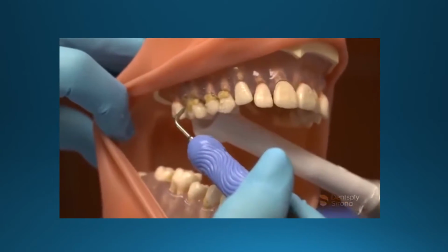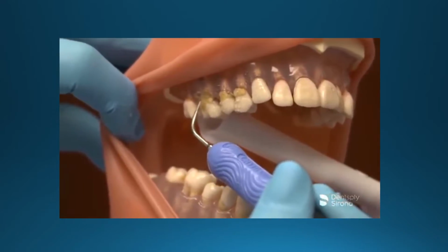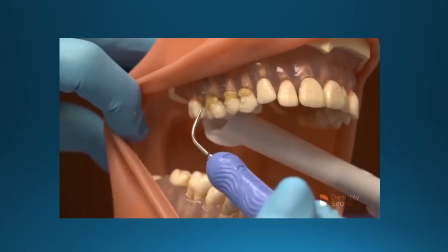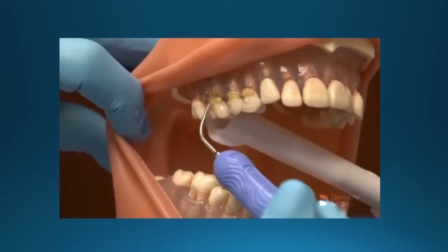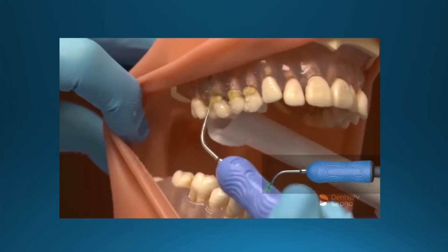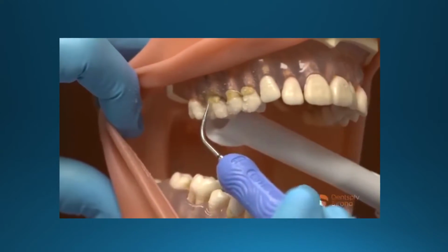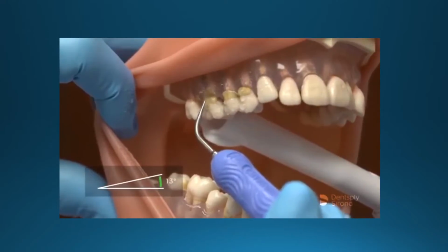Adaptation will be in the transverse oblique approach in the healthier sulcus to prevent encountering the junctional epithelium, and in a more vertical approach as indicated. The clinician adapts 2 to 3 millimeters of the terminal end and rides the anatomy towards the gingival margin in a vertical oblique orientation while maintaining an angulation of 0 to 15 degrees.